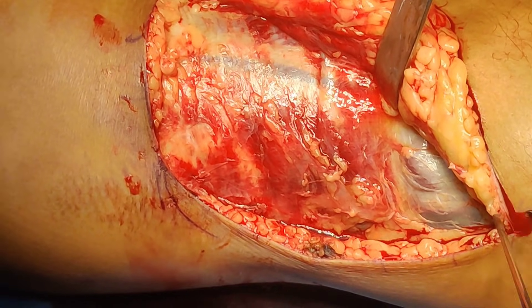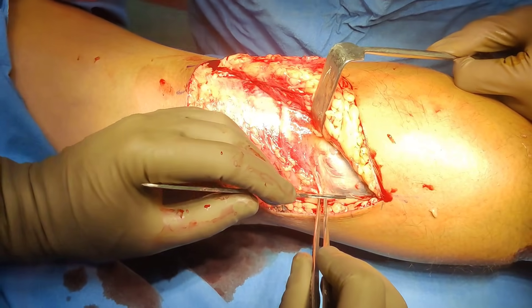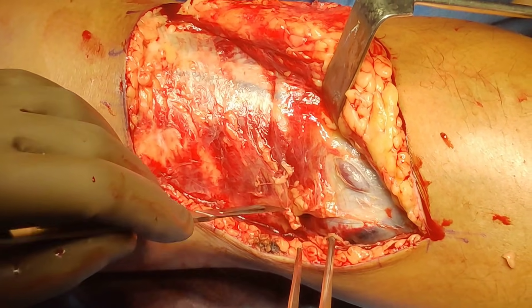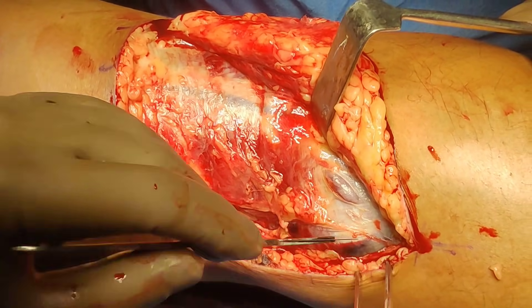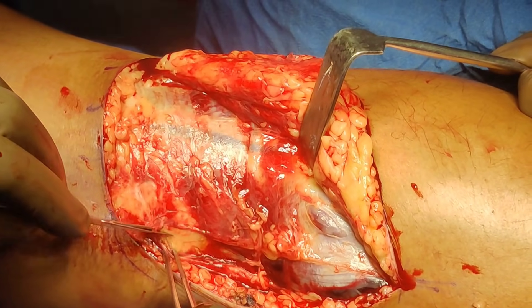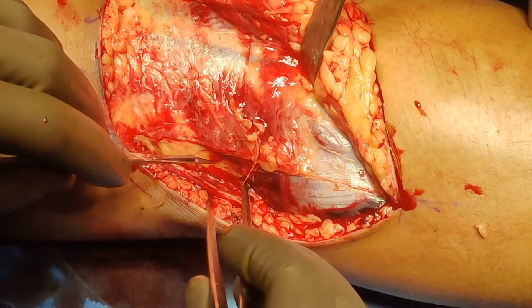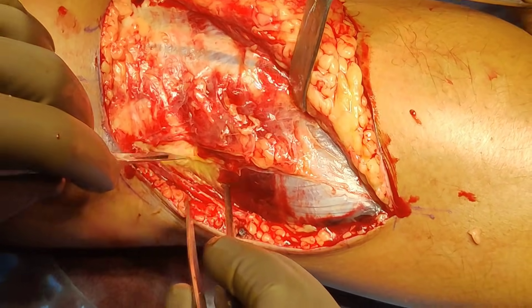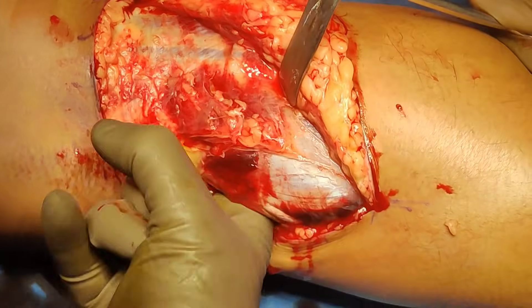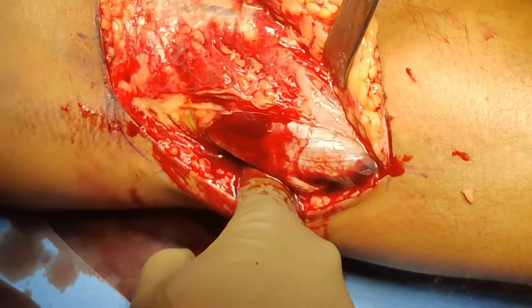This is the foot end and this is the head end. Once you see this, you start seeing the gastrocnemius muscle — we have to elevate the gastroc. Once you have elevated the skin you will see this fascia, and as I am cutting the fascia the gastroc muscle is trying to pop out. Once you open the fascia here you can see it — because the injury is in the back it's all hematoma. You can use your finger and go underneath the gastroc, and once you are underneath the gastroc you are right on the bone.